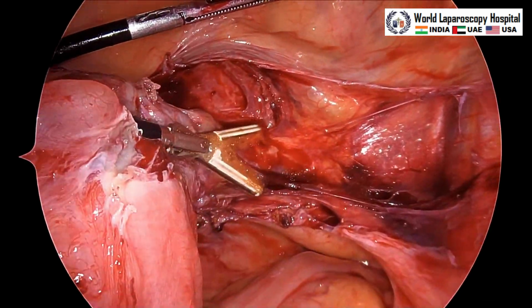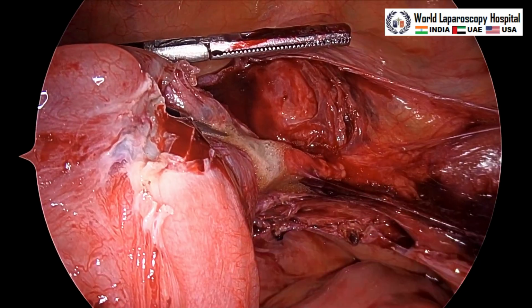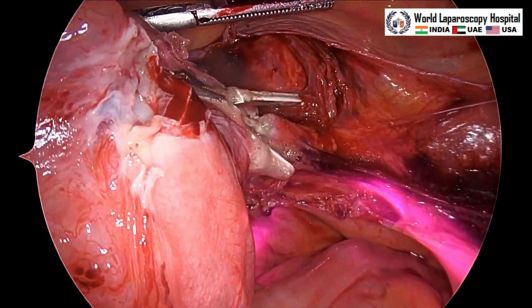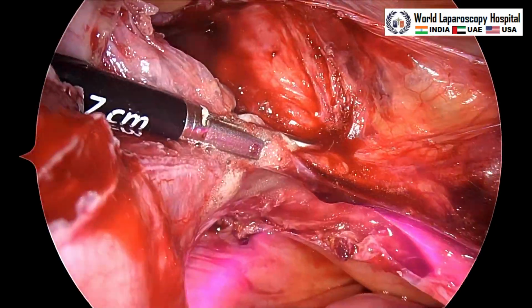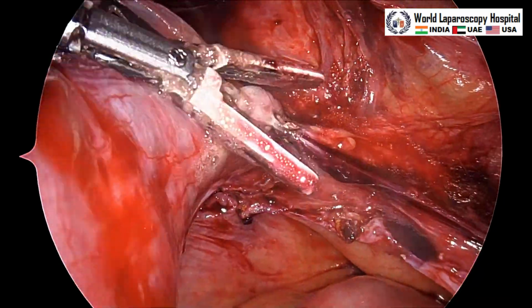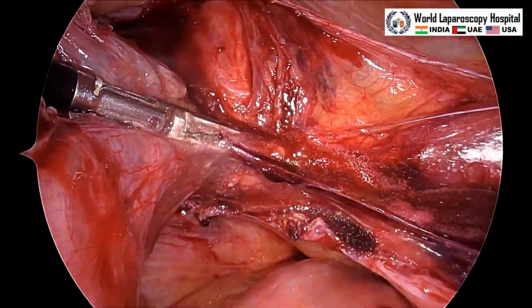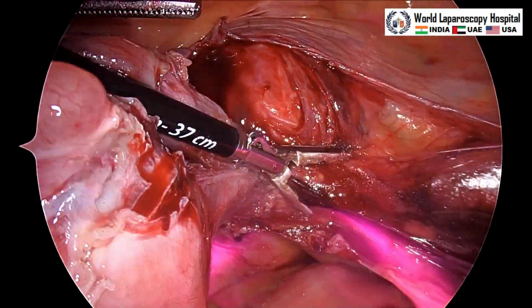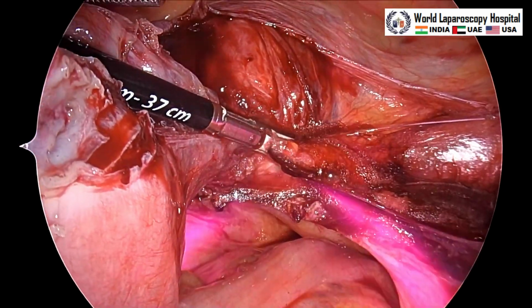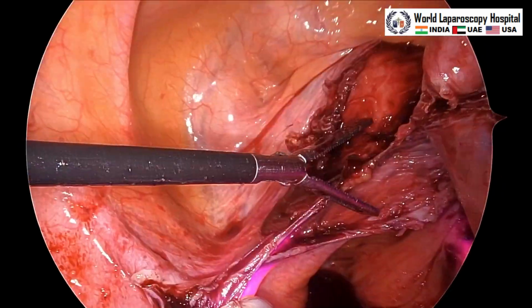So this is done, and now this is the right side of the uterine artery which is getting coagulated. We always apply a little betadine in between the jaws of the ligature, so a sticking effect will not be there, and you can see the good bubbling effect. If sticking is not there, then you have better coagulation, because the temperature will never increase more than 100 degrees centigrade.